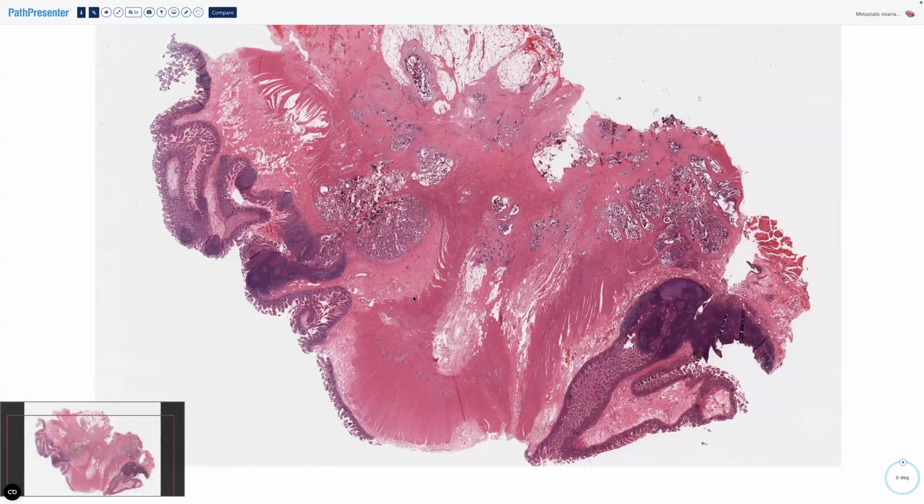These arise from the fallopian tube. So when we report their biopsy, we say serous carcinoma, high-grade serous carcinoma of tubo-ovarian origin, p53 mutated. The other thing that we often do is a WT1, because WT1, a common ovary positive immuno, is positive in these, but the serous carcinomas from the uterus, which look exactly the same and are also p53 mutated, are usually negative. So top tip is to do at least a p53, a PAX8, and a WT1 when you're diagnosing these.